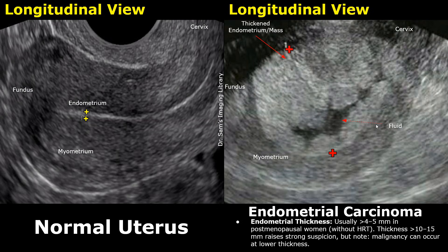Endometrial carcinoma usually occurs in postmenopausal women and the most common clinical presentation is postmenopausal bleeding. On ultrasound, the endometrial thickness is usually greater than 4 to 5 millimeters in postmenopausal women without hormone replacement therapy. If the thickness is greater than 10 to 15 millimeters, it raises a strong suspicion, but keep in mind that malignancy can occur at lower thickness.